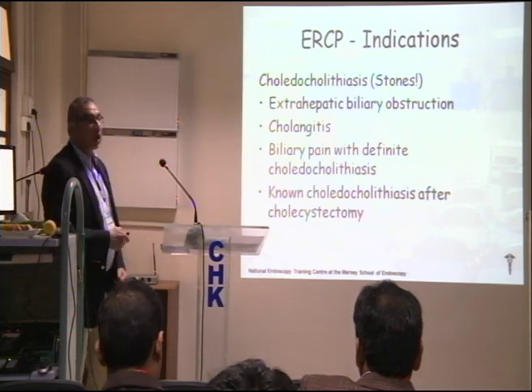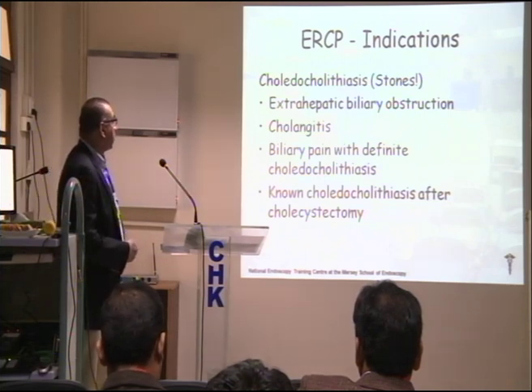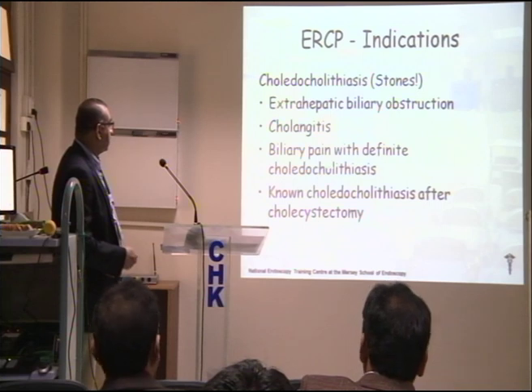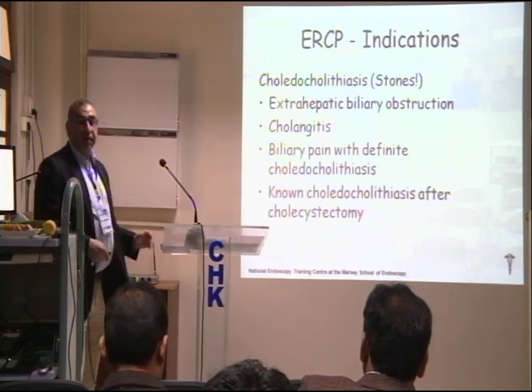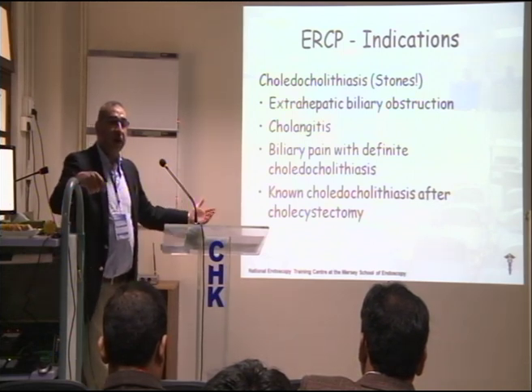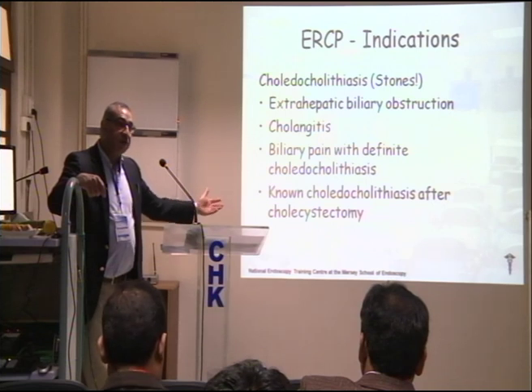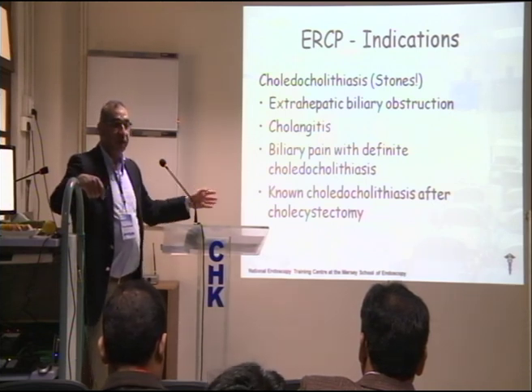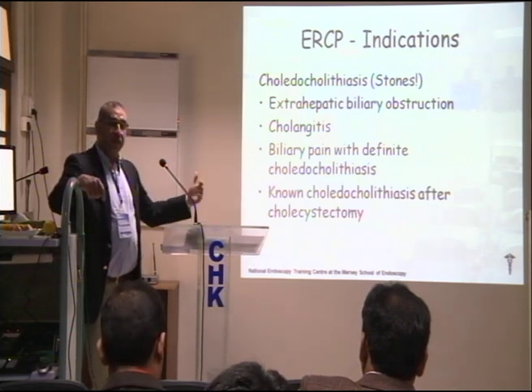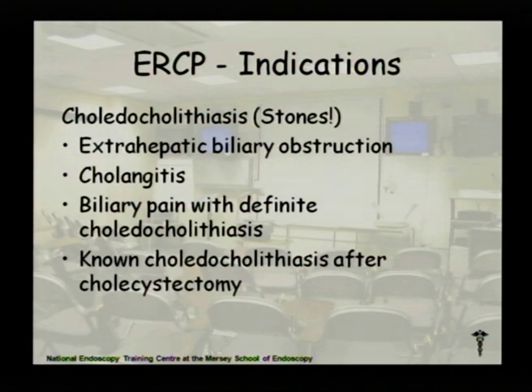Okay, so coming back to indications again, choledocholithiasis is one of the commonest indications for ERCP, right? It can cause extrahepatic biliary obstruction, cholangitis, pain, and sometimes when people undergo cholecystectomy laparoscopically, the common bile duct is not explored, or they explore it and find that it's got stones in it, then rather than do an open drainage procedure, because that is a major surgery with more morbidity, longer post-operative stay, most of our surgeons would just close, take the gallbladder out, and ask us to do the ERCP to clear the duct.